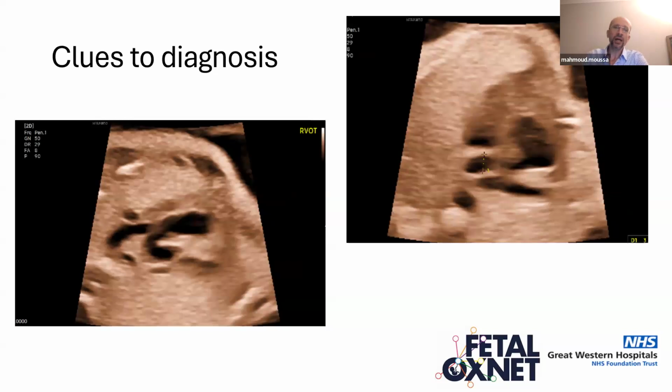There are some clues for the diagnosis. If you see a 4th vessel, then maybe if you slide slightly to the pulmonary artery or the right outflow, you could see the vessel slightly more clearly, so you can see it slightly bigger if you're thinking there is an artifact.